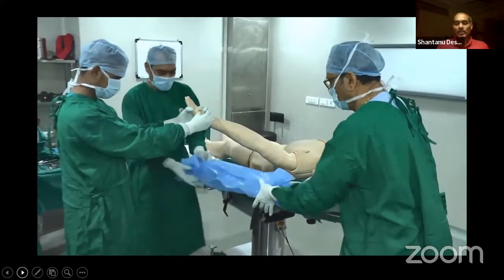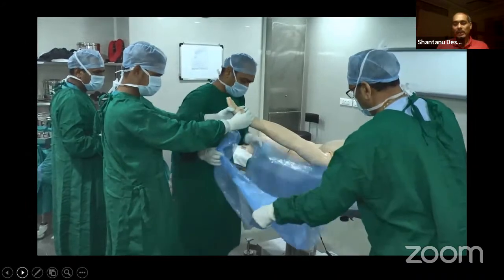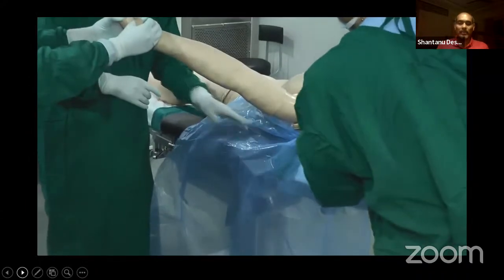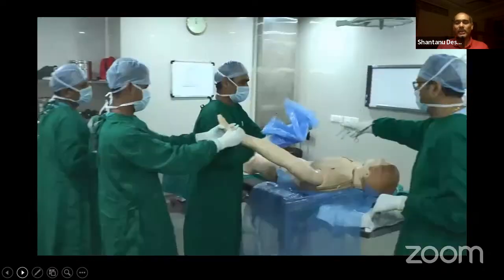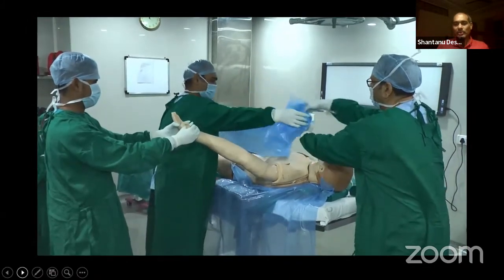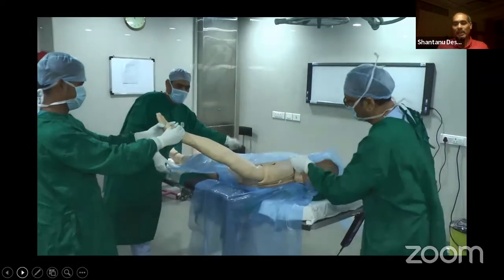So the plastic sheet which is used initially, we take a swab holder and make sure that it is pushed underneath the body. Taking another drape from the top, a plastic drape. So two plastic drapes usually help you to cover the entire body.